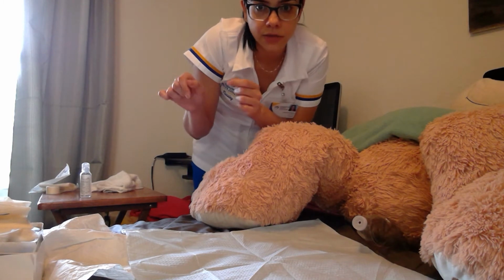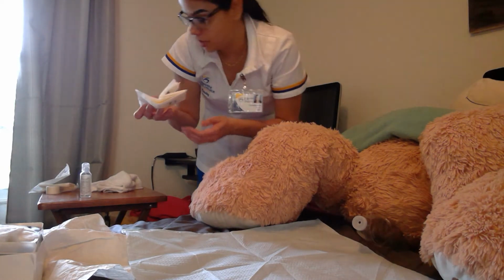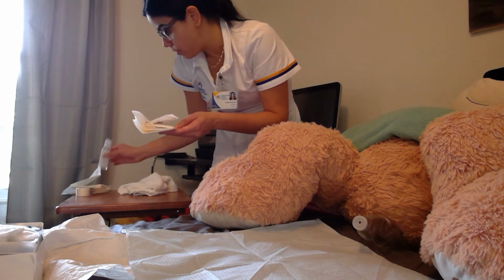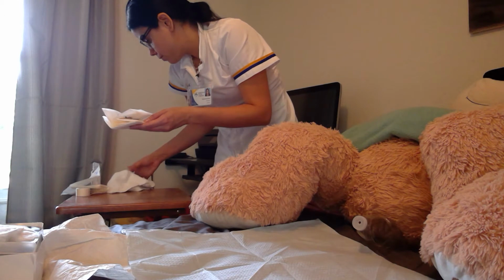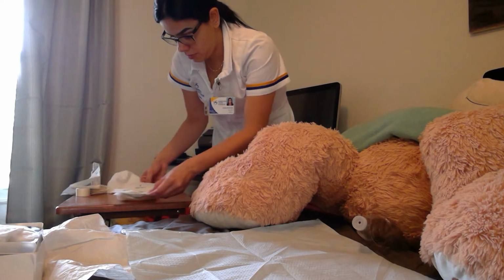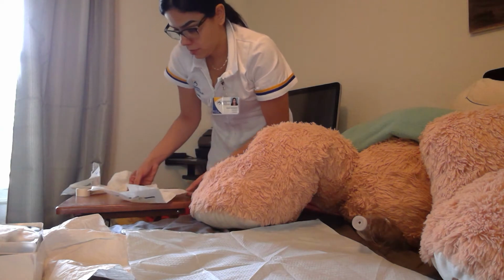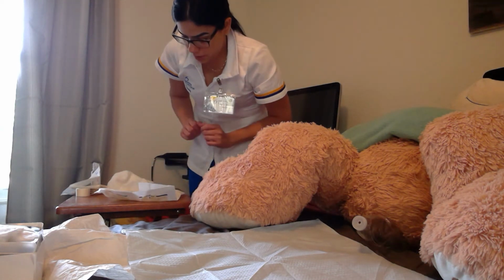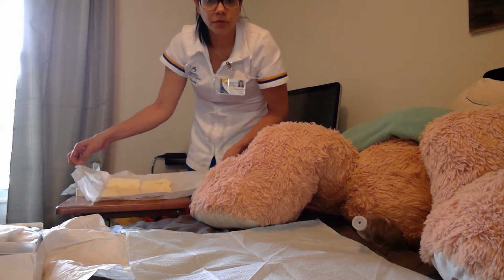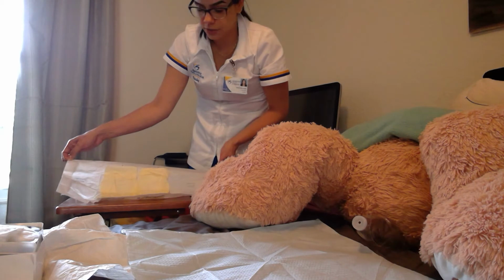So that's the second thing that is gonna be on my tray, I should say, my sterile gloves. So now I am going to put my sterile gloves here so you can see how I'm doing it. Okay, and I'm gonna put it on this table. Okay, so I open them, and I'm gonna touch only the corners of this paper, exposing now my gloves. Okay, I'm not touching my gloves, I'm just exposing them.